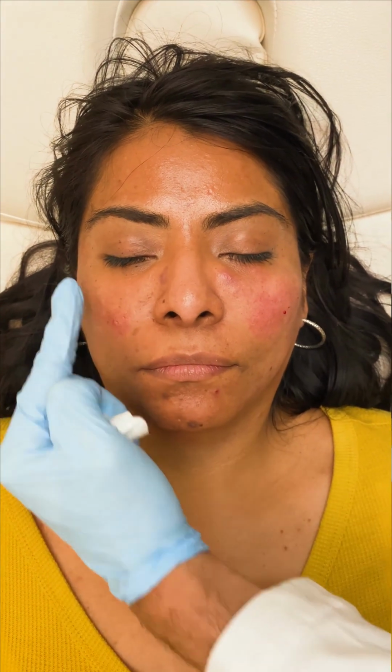And again, you can see that difference between the left and right side there. Still, this is the most swollen it's going to be, but look at how you can see that shape there. You can see that structure definition compared to a little bit more flat on the right side. And it's not going to move either. The products I'm placing in there are just going to stay where I place them.